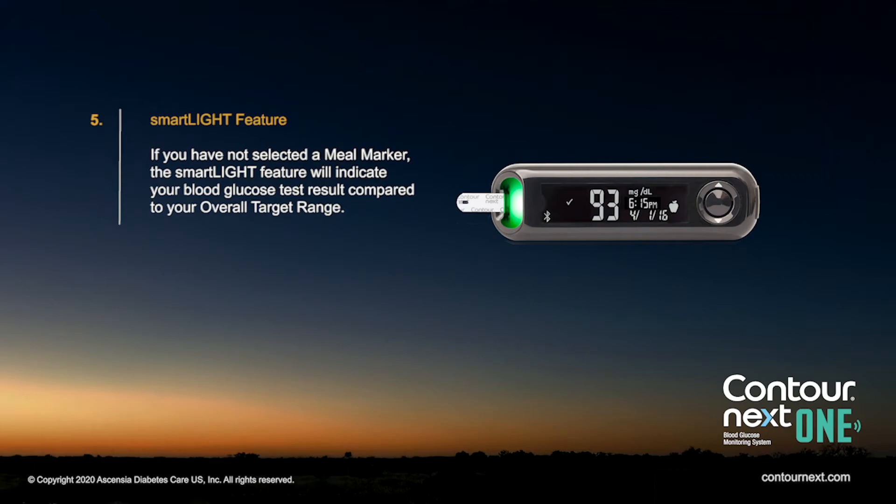If you have not selected a meal marker, the SmartLight feature will indicate your blood glucose test result compared to your overall target range.